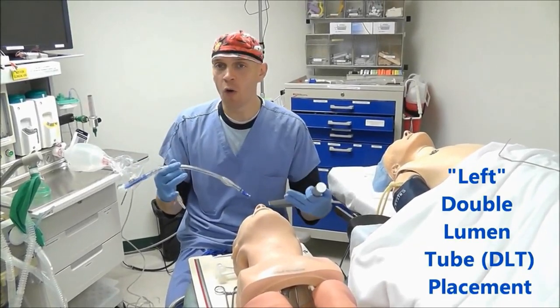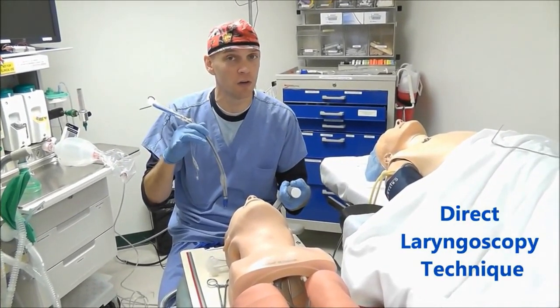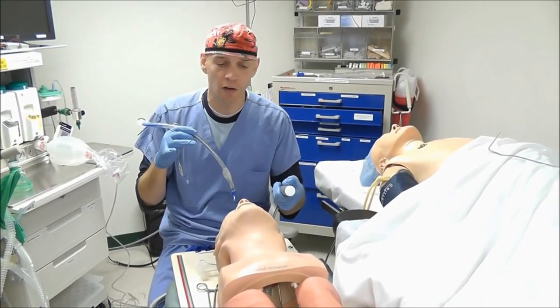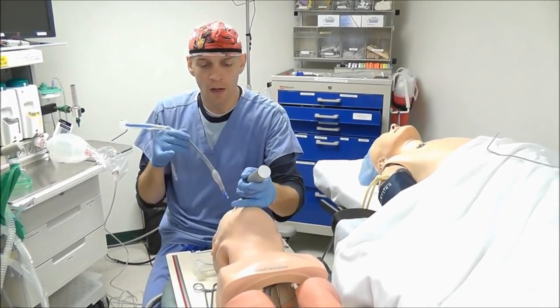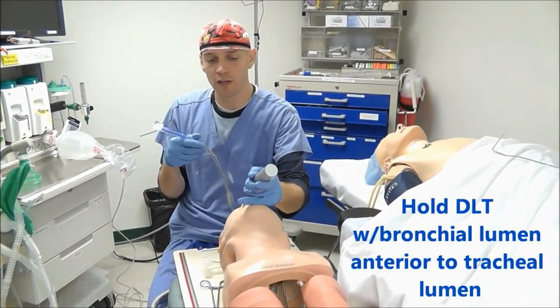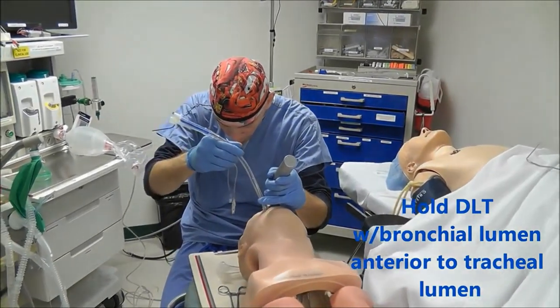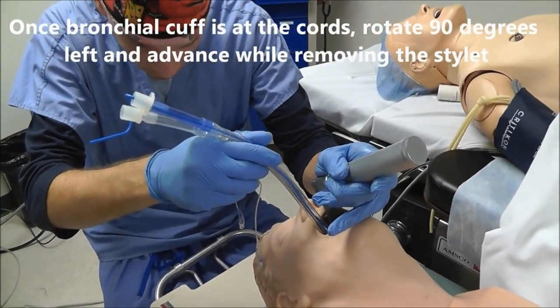Okay, today we're going to go over double lumen tube placement, and the technique that I'm going to show you is direct laryngoscopy. So when you're going to insert a double lumen tube, you go ahead and do laryngoscopy like normal. Then when you're ready to insert the double lumen tube, you're going to want the bronchial lumen in front of the tracheal lumen. So then when we get our view, we go until this bronchial lumen gets to the level of the vocal cords.